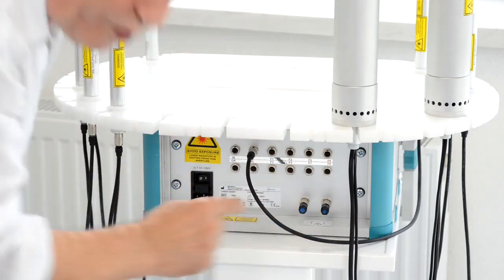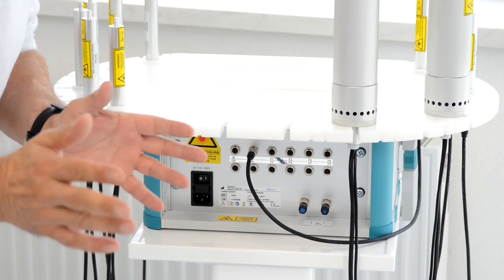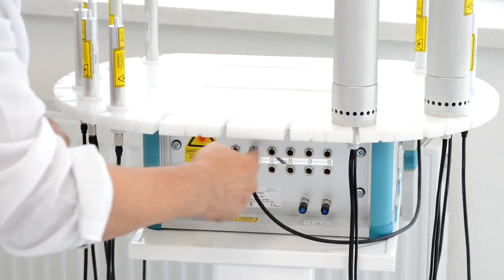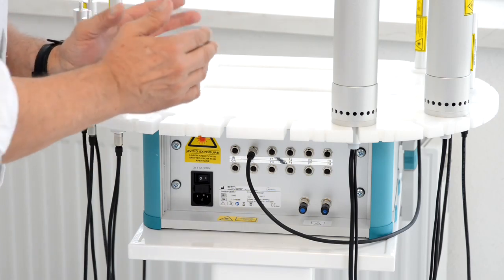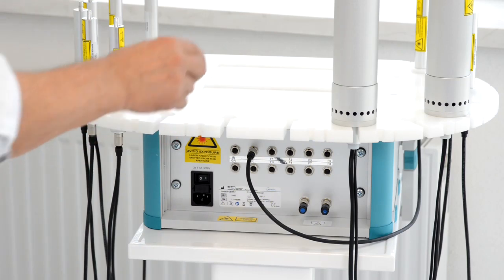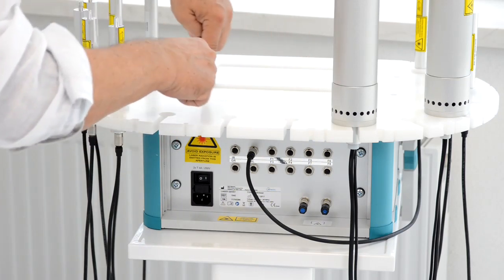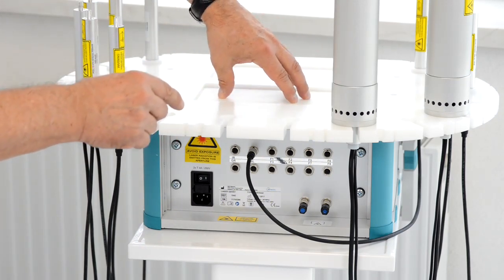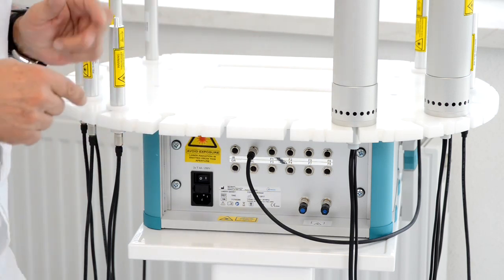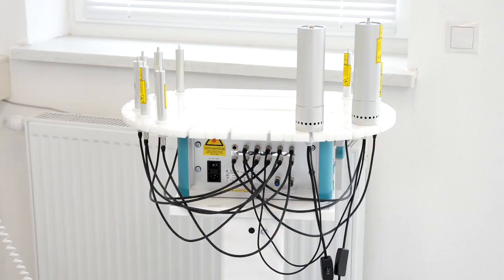All the other ones, the so-called free channels, you can connect any laser. So in principle you can connect any laser to each channel. The only thing is that you know which laser is connected to which channel. At the end you should write a small list and put it on the device that you know exactly on which channel all the different lasers are connected.